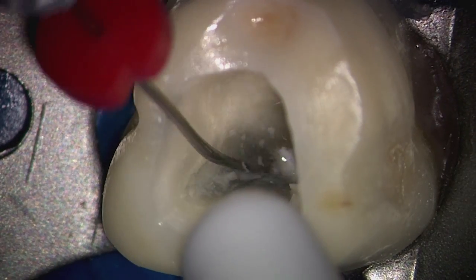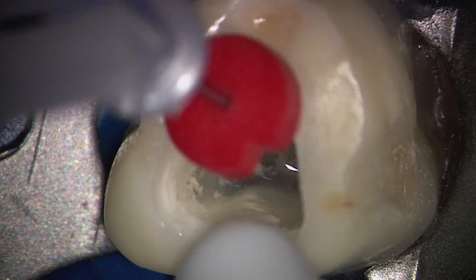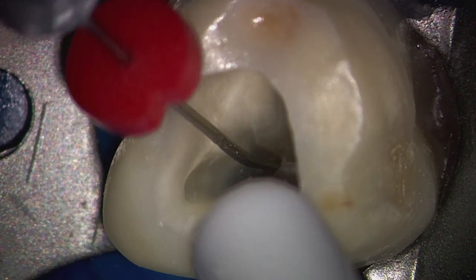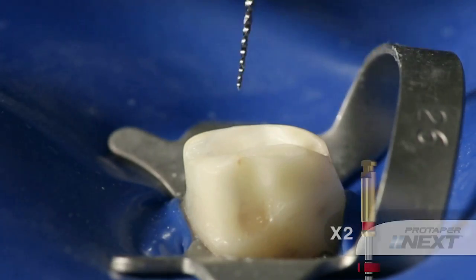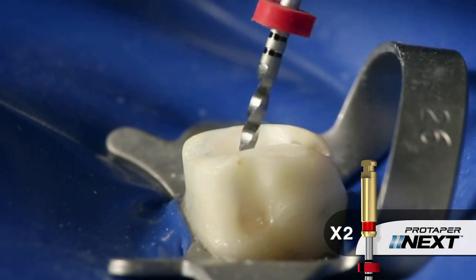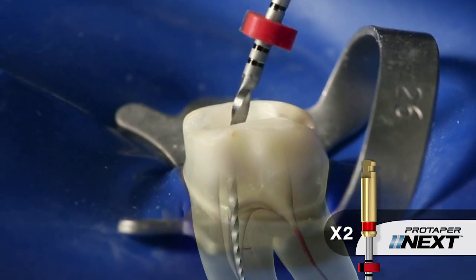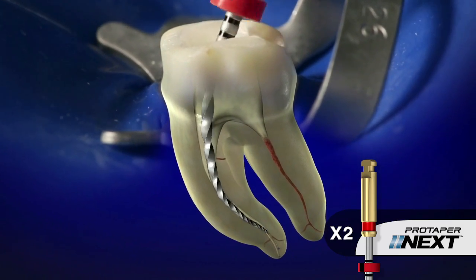When we've achieved length, as usual, irrigate to kick out gross debris, then use the TIN file to break up residual debris and move it into solution, then re-irrigate to liberate this debris. We can now continue on using the ProTaper Next X2 file. From the lateral view, you can really see I'm emphasizing brushing. Brushing gives us more centered preparations. It maximizes remaining dentin on the furcation side, and it ensures that we're making more contact than just using a pecking or pumping motion.